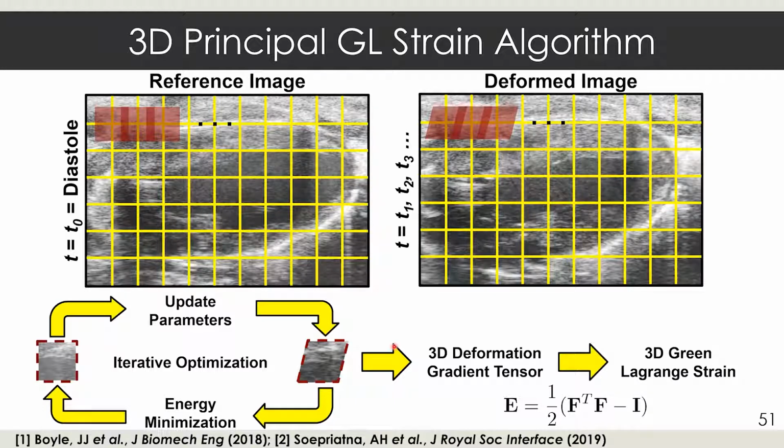But that doesn't mean we can't go back and look at longitudinal strain and create a GLS-like metric at each of these slices for comparison to 2D data or other studies. But in general, where we see high first principal component Green-Lagrange strain, we're going to find high global longitudinal and global radial strain numbers as well, and vice versa with low strain values for global strain and Green strain. Anything to add to that, Arvin? I think you summed it up perfectly.